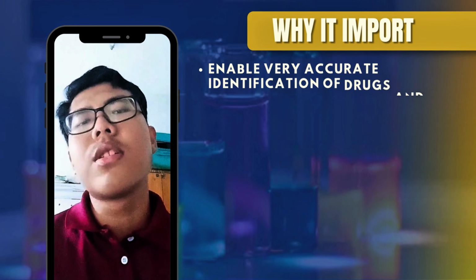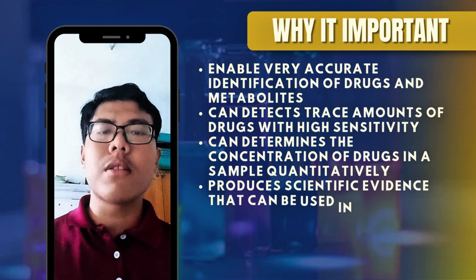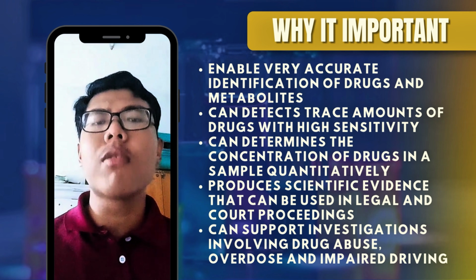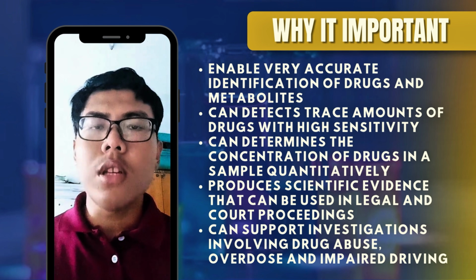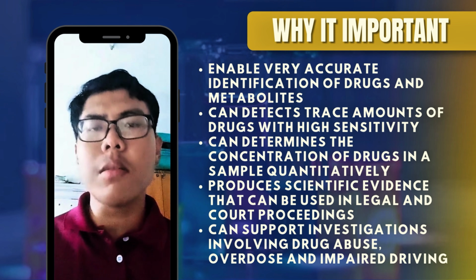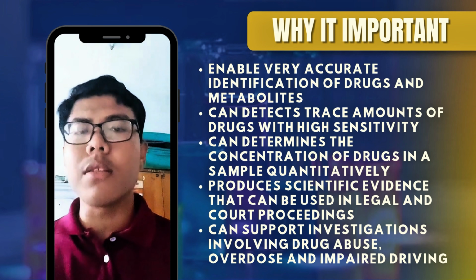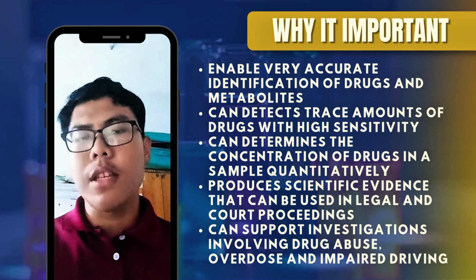This method is very important because it's very accurate, even when we need to find a substance in a small amount of sample. It can also help to measure the concentration of drug in a sample, and the result can be used as evidence in court or in a police investigation.